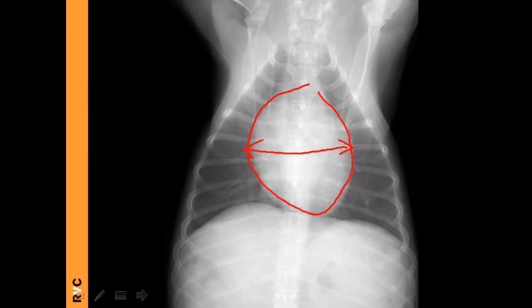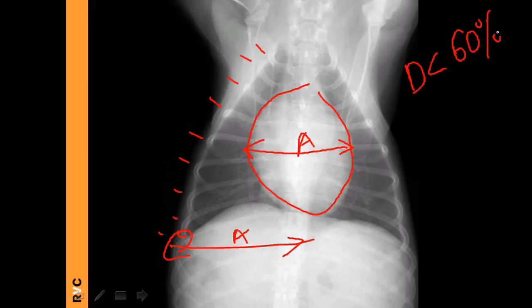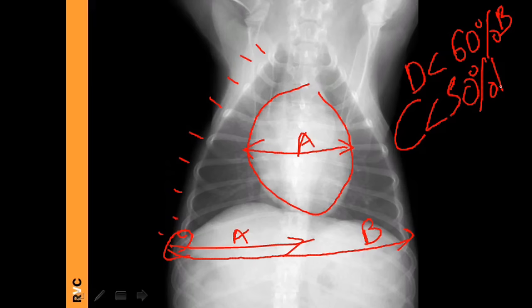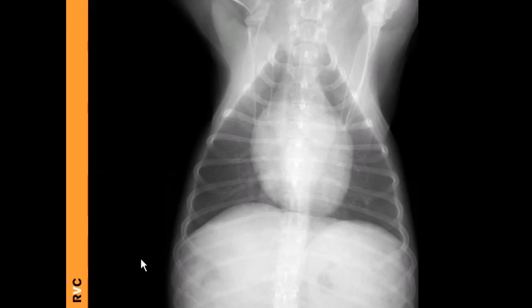On the VD/DV view, the cardiac silhouette measurement: measure the maximal width of the cardiac silhouette, then go to the ninth rib level and compare. In the dog, the maximal width of the heart at the level of the ninth rib should be less than 60% of the width of the chest. In the cat, it should be less than 50% of the chest width at the same level.